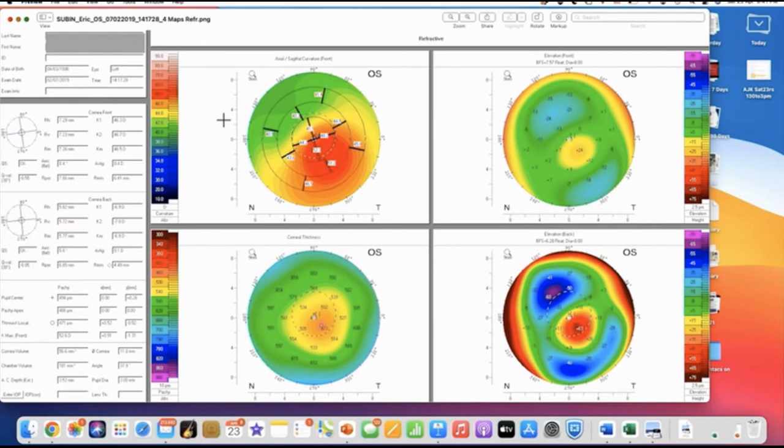Okay, patient had cross-linking 2 years ago. He's miserable. He's an investment banker in New York, 28. He probably makes 5 times the money I do, but that's life. And he's been told to have a cornea transplant. There's no other solution. So do we graft this guy?